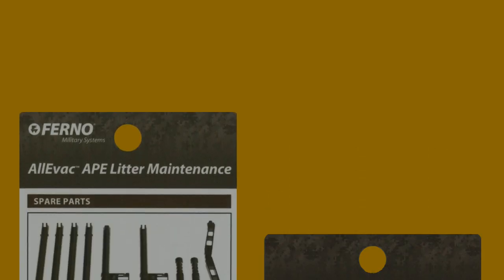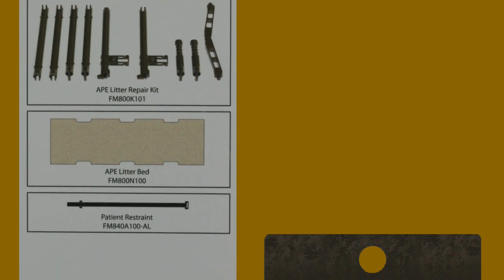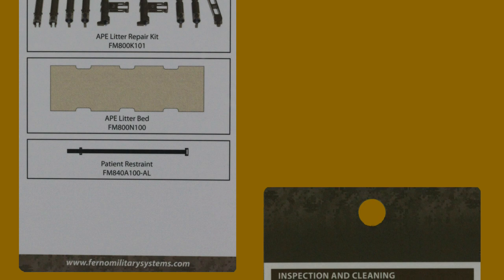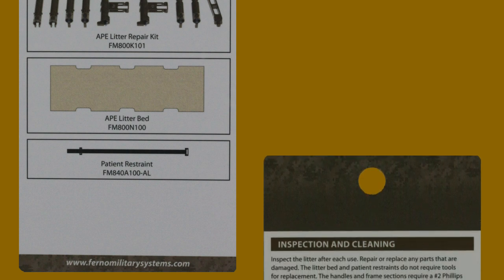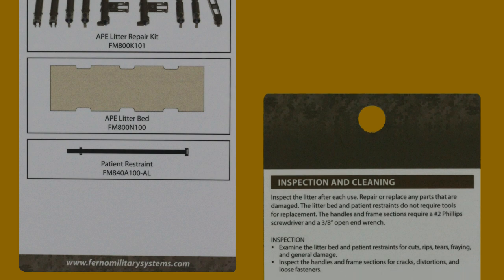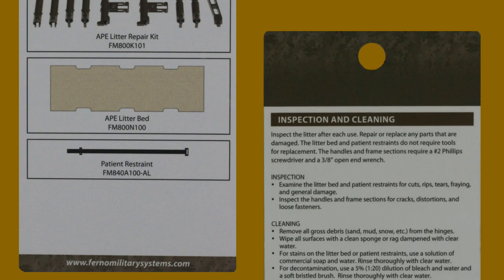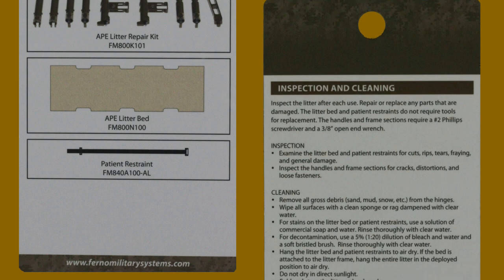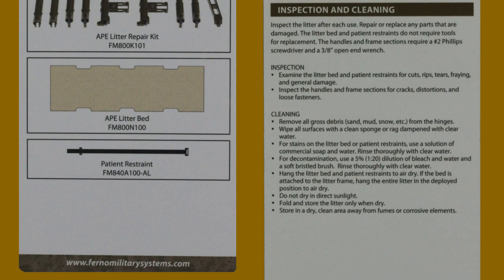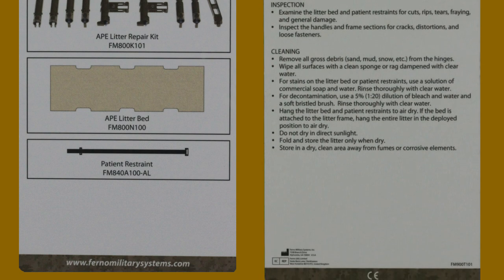Litter repair kits, litter beds, and patient restraints are available from the manufacturer. Inspection and cleaning: inspect the litter after each use and repair or replace any parts that are damaged. The litter bed and patient restraints do not require tools for replacement. The handles and frame sections require a number 2 Phillips head screwdriver and a 3/8 inch open end wrench. Additional inspection and cleaning instructions can be found on the information card that comes with each APE litter.